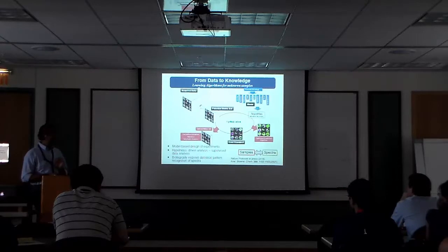If you don't do that, the danger is you have a tremendous amount of data, right? You can spend all day and extract all kinds of information from it, right? And it'll work on one data set. The minute you go to the next data set, it's going to fall apart, okay? So most of the studies in this field actually suffer from this problem. Unless you go through this rigorous process, you really cannot end up with something that actually works all the time.